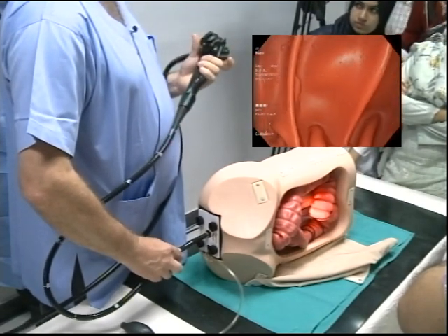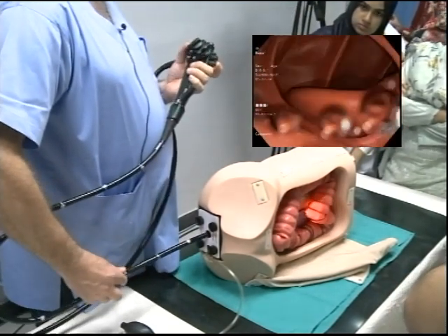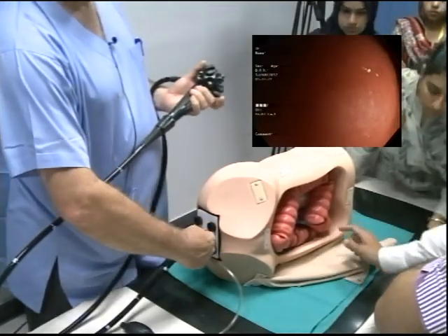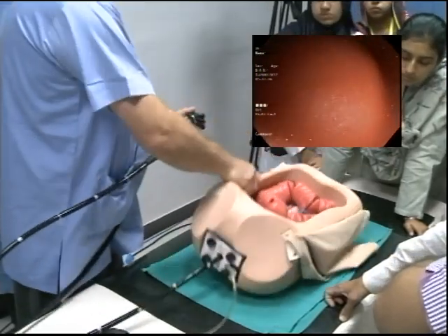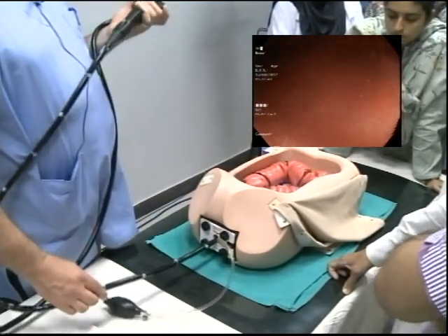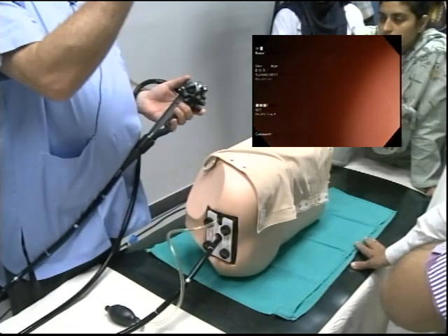Now I haven't got any pressure at all on the abdomen, I wouldn't want to. And then you can see it pushing out of the sigmoid. As soon as you feel any bits of pressure, draw back the scope. See how much you're coming out with the scope? How much have we got? How much is there? 45 centimetres. Where's the tip of the scope? So a lot of you are in and you're saying 45 centimetres and you're still here. I'm saying to you, you can often get to the cecum with 60. If I want to get round this, I would actually put this patient in this position. And the reason for that, it opens up the splenic flexure.